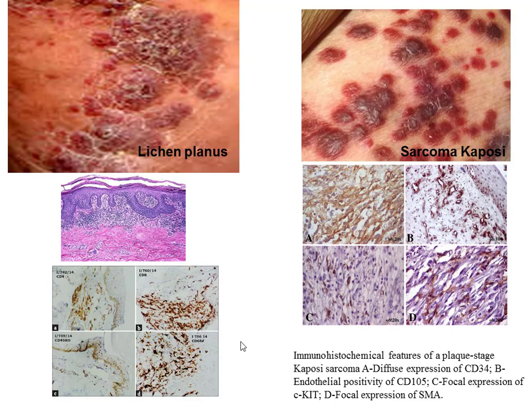Here you can see another example of how immunohistochemistry can help us. In the upper picture, we can see red patches on the skin, slightly elevated above the skin level, with a round or oval fusiform shape. They look the same, but they can be different histologically.